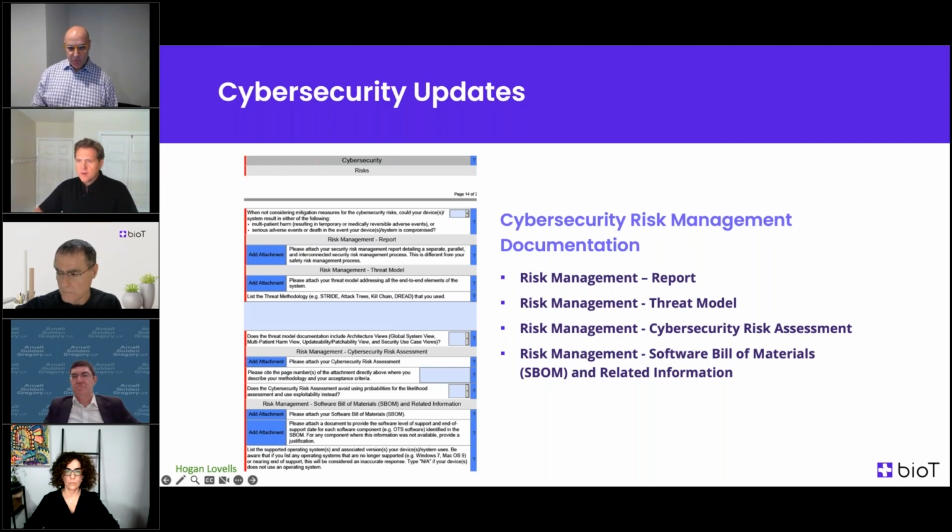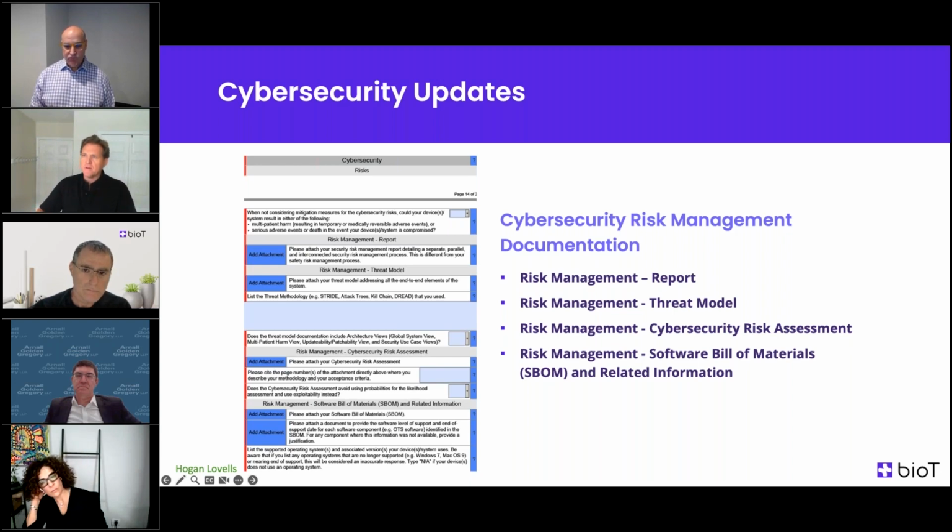But just quickly, we'll go through the eStar. It's asking for a risk management report. 95% of our clients are using STRIDE threat methodology. Microsoft has a nice tool on their website. A lot of my clients in Israel prefer the OWASP Dragon tool. They say they find that easier to use. And you can build these threat models in like an hour using YouTube videos. I mean, you can pull them together pretty quickly at a high level.